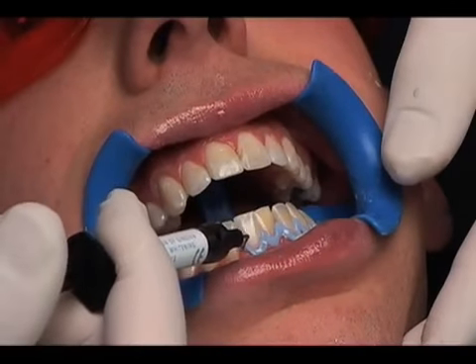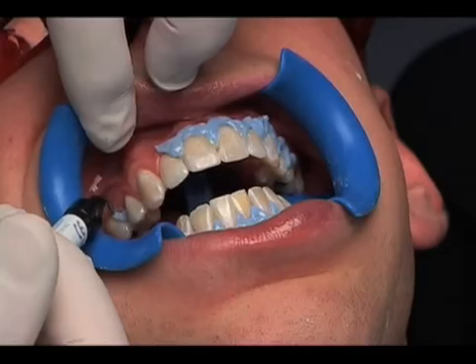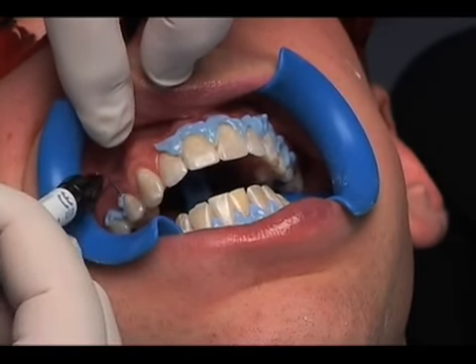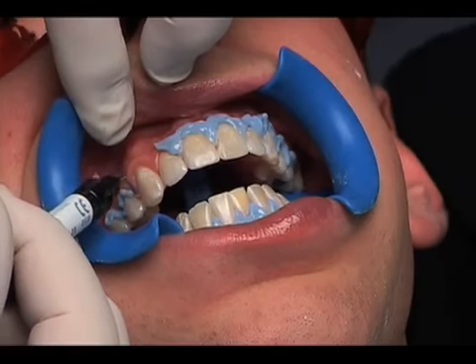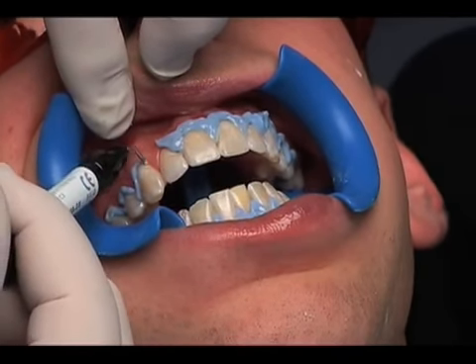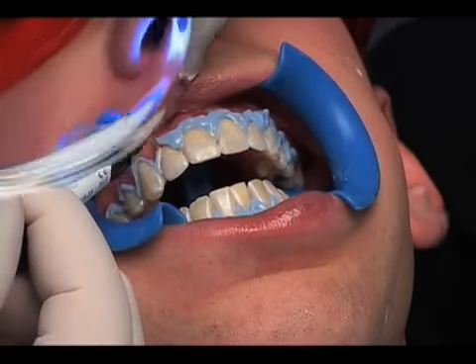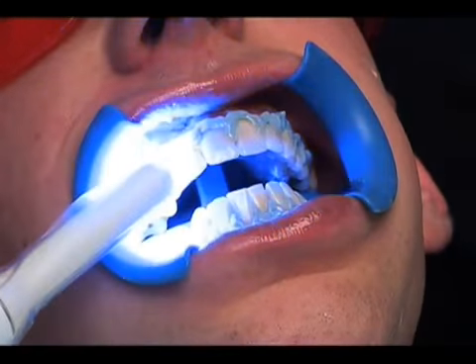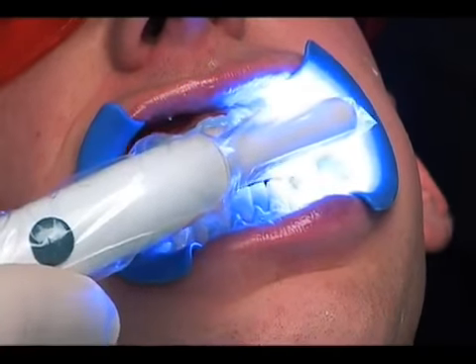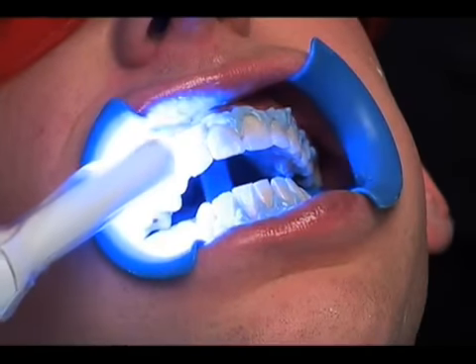Once dry, slowly apply gingival barrier to both arches. Overlap the enamel and interproximal spaces by about ½ millimeter, paying extra attention to interproximal spaces. After this first application, apply another level of the gingival barrier until it extends about 3 millimeters on the gingiva. Light cure the gingival barrier in a fanning motion for about 10 seconds until cured. Use an explorer or other instrument to be certain all areas are cured.